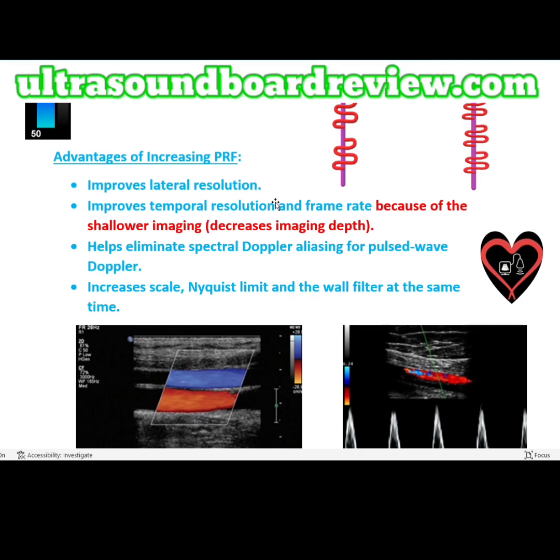You might not be asked what are the advantages of PRF or the disadvantages, but you might be asked what will happen when you increase your PRF or what will happen when you decrease your PRF. Let's start with the advantages of increasing PRF, and what this will do is improve lateral resolution.